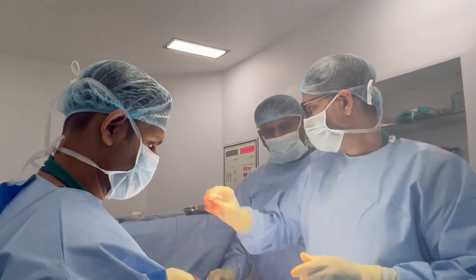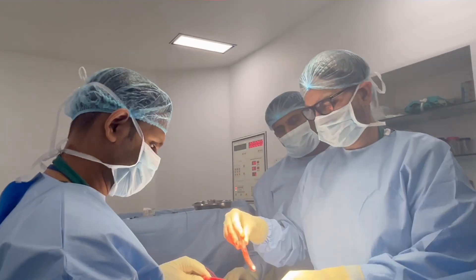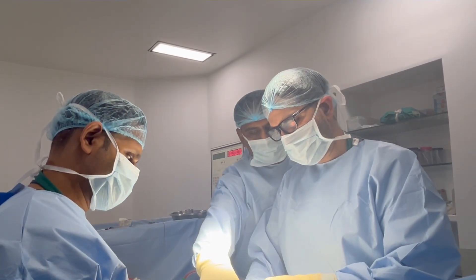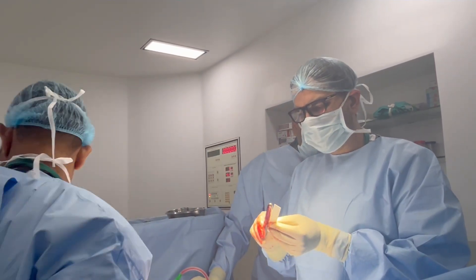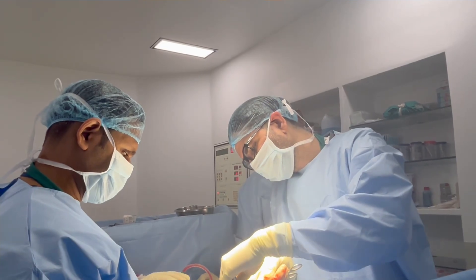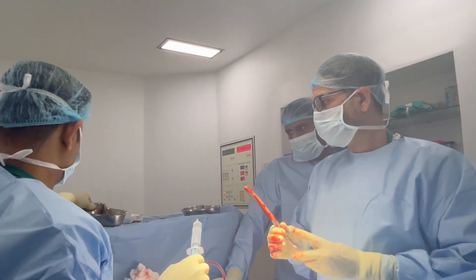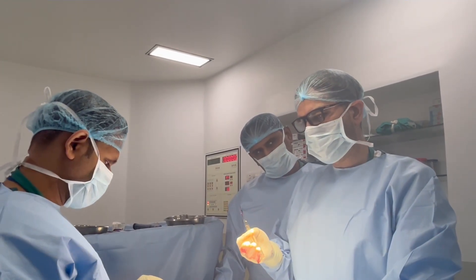Now we have dilated it to 13 mm diameter. Now we will measure it. Distally 10 cm and approximately 12.5 cm proximally — so 10 and 12.5, total 22.5 cm. The length is quite good: 22.5 centimeters. Now we have dilated it — 22 cm length and 13 mm diameter.